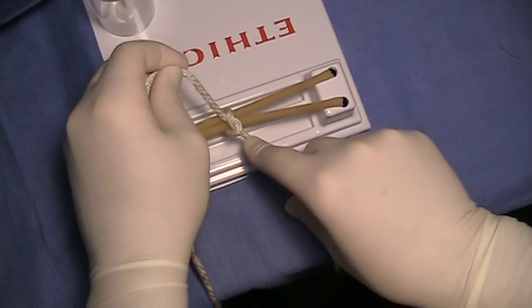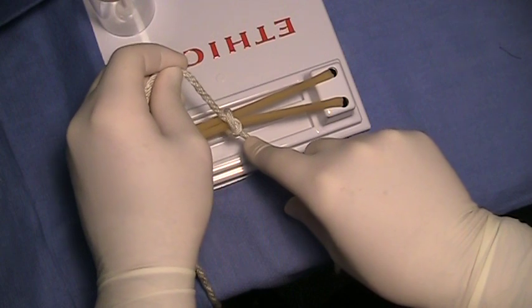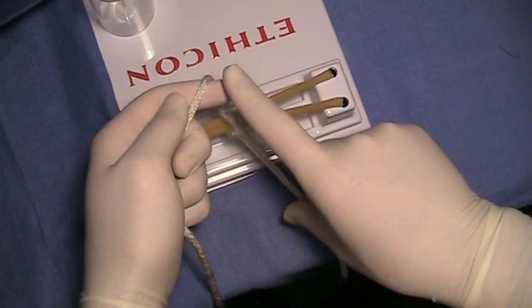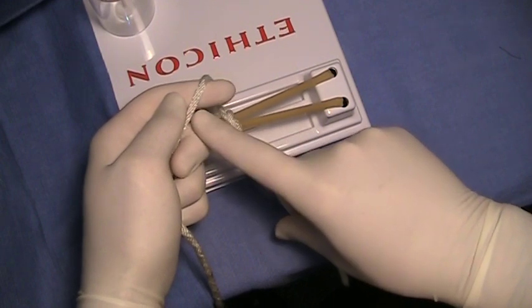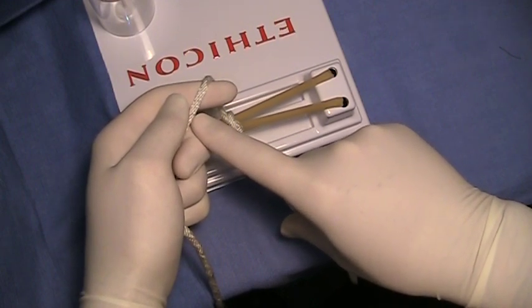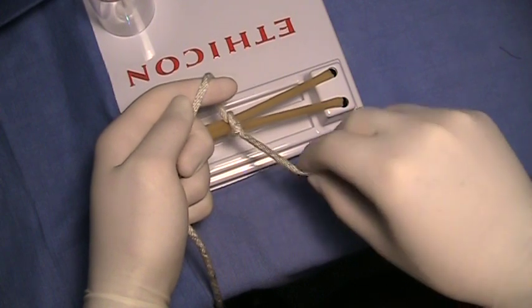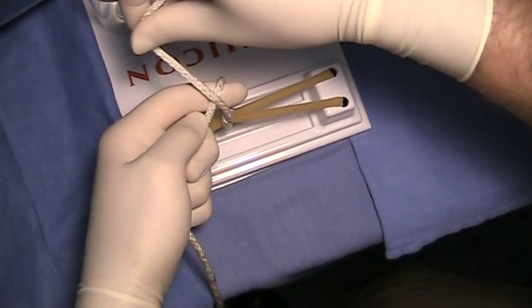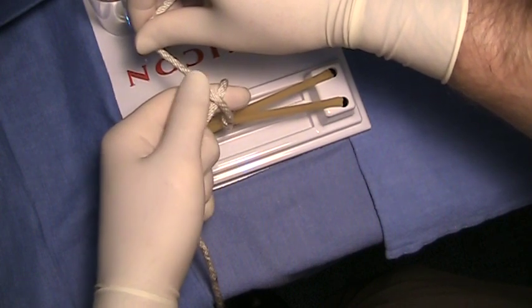For the next throw, keep tension and keep tight with your left hand. You'll have to drape the long end from right to left, from top to the bottom of your index finger. You'll then use the short end to drape over from right to left, from bottom to top this time, to create your X from bottom to top.